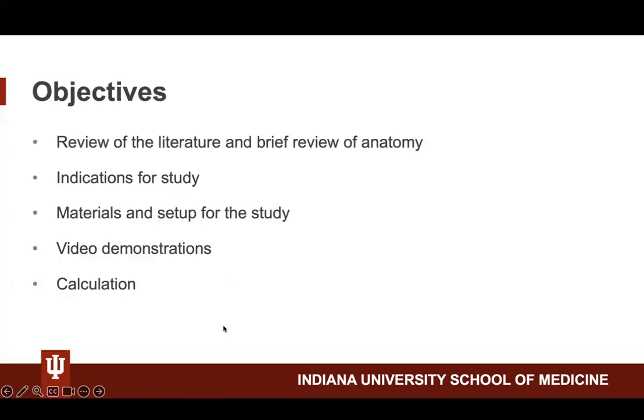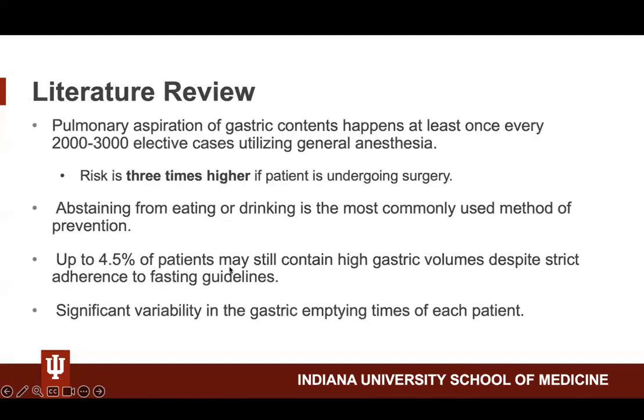The objectives of this presentation include a brief review of the literature, indications for gastric ultrasound, general setup and protocol, video demonstrations, and we will walk through how to calculate gastric volumes, including their significance.